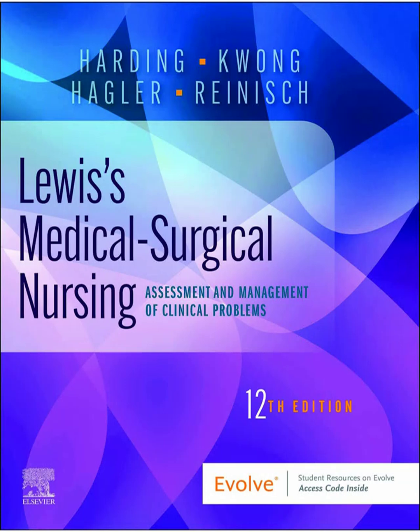How do you fix those? Troubleshooting involves checking all the connections first, especially for temporary pacemakers, checking the battery. Then adjusting the pacemaker settings, like increasing the output, in milliamps, to fix failure to capture, or adjusting the sensitivity setting to fix failure to sense. This usually requires specific training or collaboration with cardiology or a pacemaker nurse.